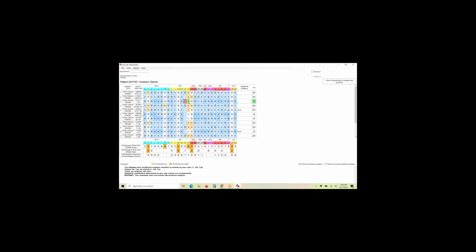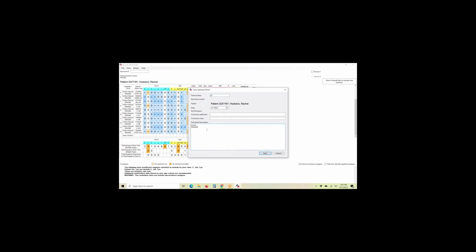We know that the chance that this cell here, number 3, is JSA positive, and number 6 and number 7 and number 10, the chance of those all being JSA positive is very low. Actually, this one is positive, number 10 is, but the chance that all of them are is very low. So most likely it's already excluded. But we're going to run that other panel and see if that clears it up. So we're going to do that just for the demo. Let's go ahead and save this as a merge.